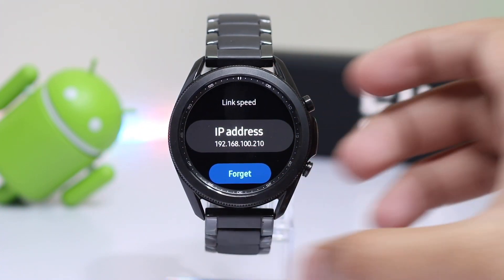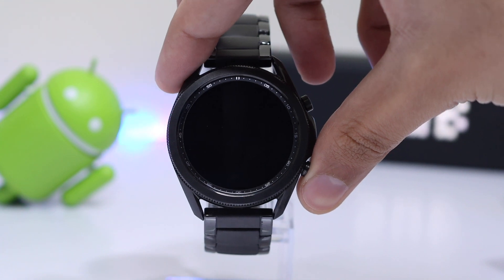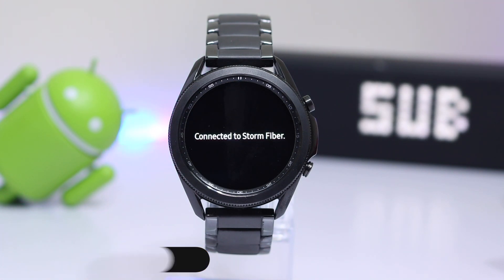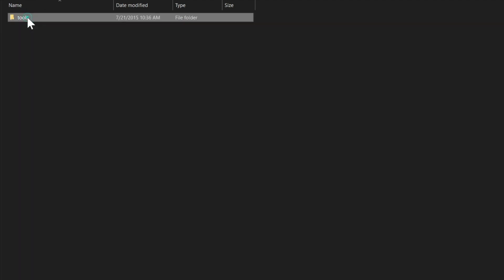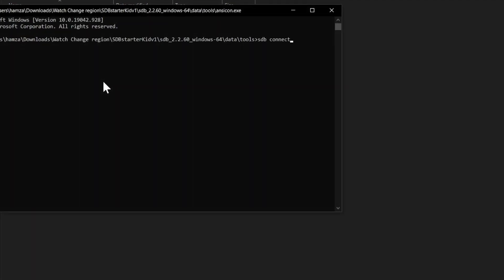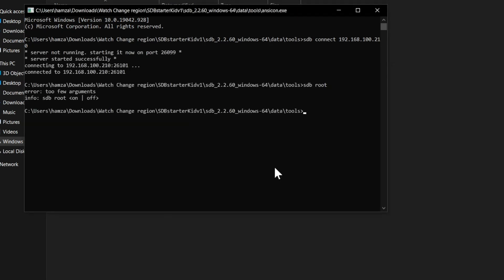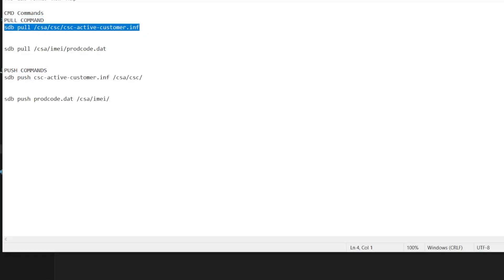Scroll down and note the IP address shown on the watch. Reboot the watch by long pressing the Power key. After rebooting, it will automatically connect to the same Wi-Fi as your PC. Now go to the SDB folder on your computer, unzip your desired version (I have Windows 64-bit), then navigate to Data, then Tools, and select the console. Enter the command: sdb connect followed by the IP address noted from the watch. Then enter sdb root to turn on root mode. Finally, enter the pull commands to pull files from the watch — you can copy these commands from the description.